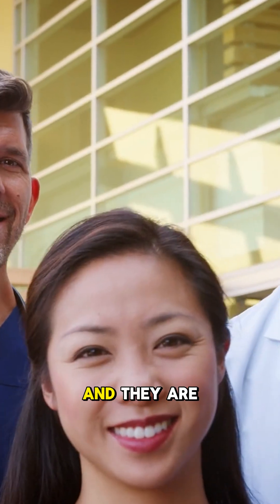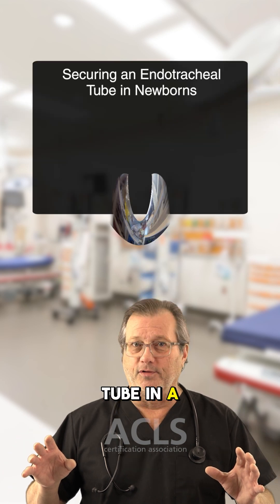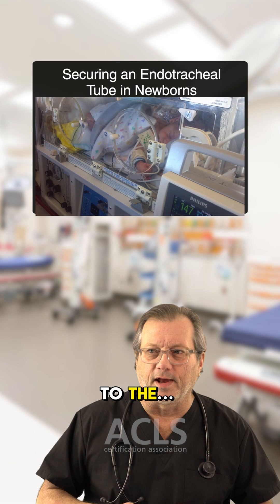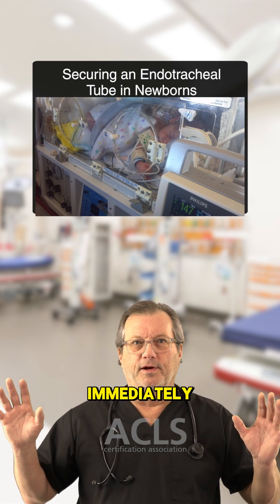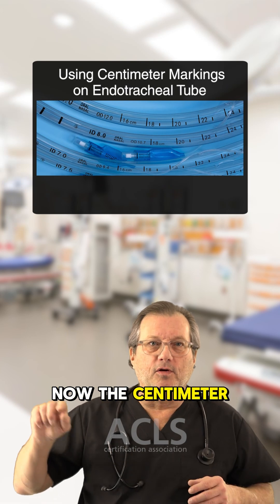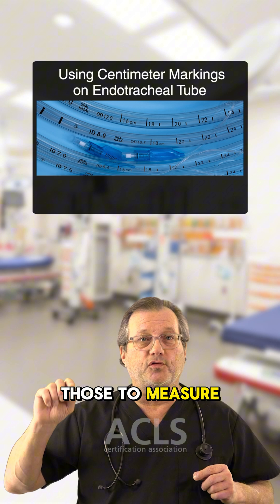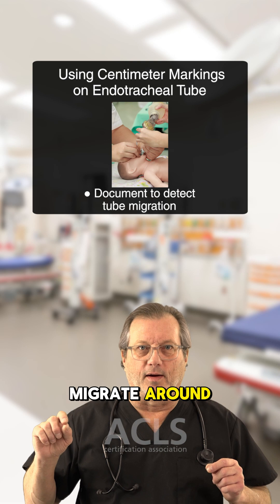I've flown with NICU teams and they are real particular about how they secure that ET tube in a newborn — you just back off immediately. Now these centimeter markings on the side of the ET tube, we're going to use those to measure where our tube winds up and then document that to make sure the tube doesn't migrate around.